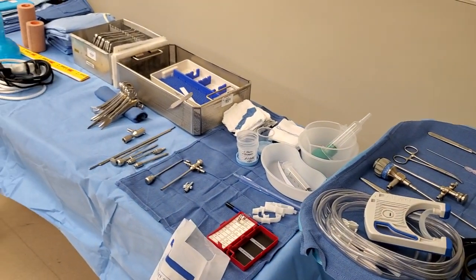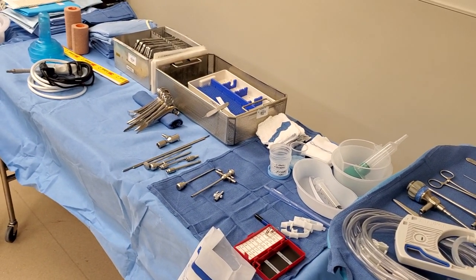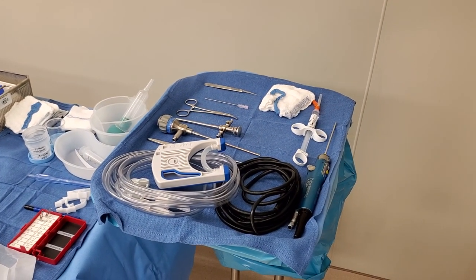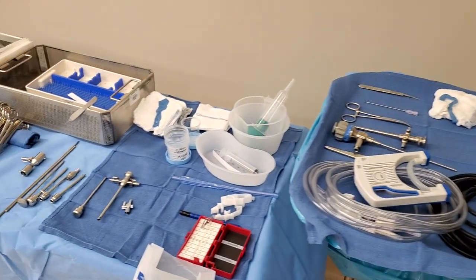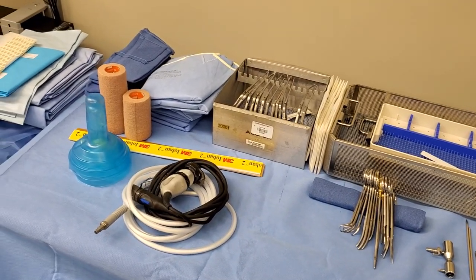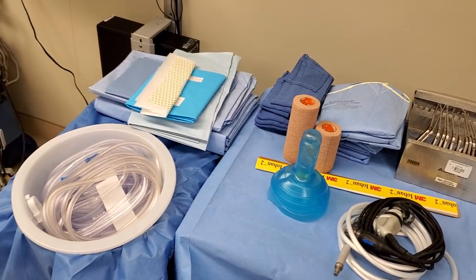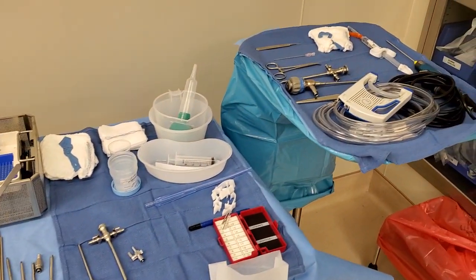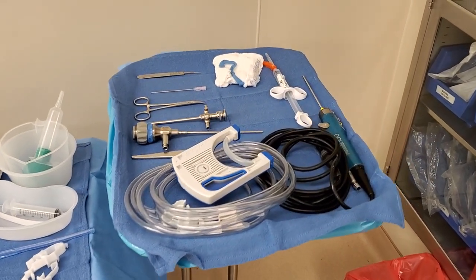Hey guys, this is my setup for shoulder arthroscopy — just an overview. I'm a little shaky today, I'm wearing boots. I've never worked with this surgeon before so I just know the super basic stuff.